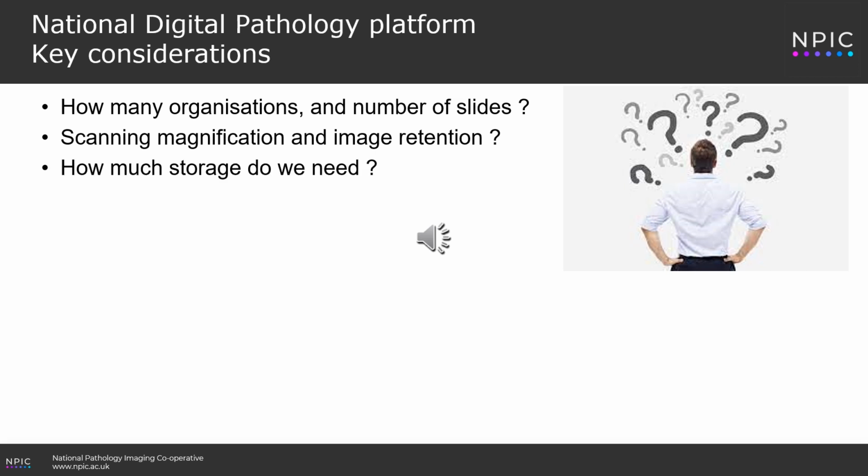How much storage do we need? Depends on your scanning magnification. You'll see later on what we've put in place from a storage perspective. How many users access the system? This really links to how many pathologist workstations you need, and also how many medical grade displays you'll need to procure.